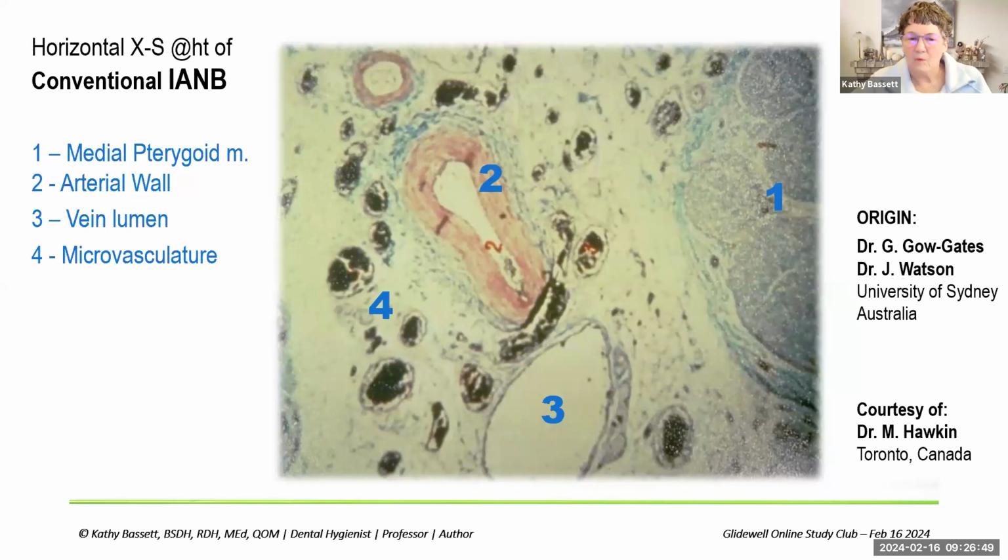And keep in mind that when we're doing our aspiration process and you have a positive aspiration, mostly you're picking up extravascular blood from small microtraumas to that microvasculature. It's really not that common that we literally enter into the veins and the arteries. Number 1, veins aren't really pressurized, so generally they're kind of collapsing.